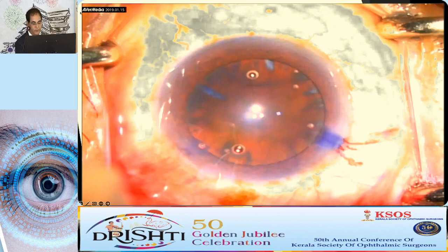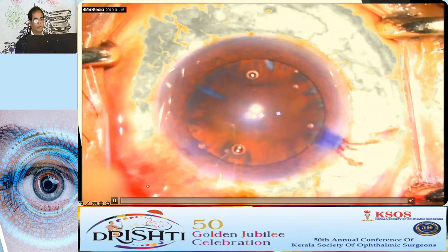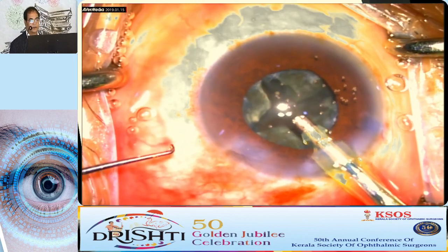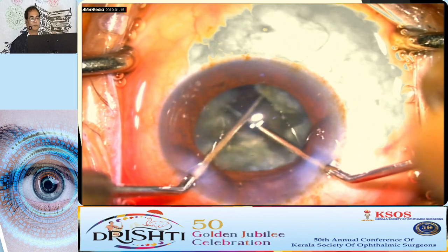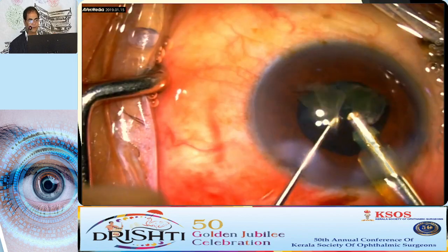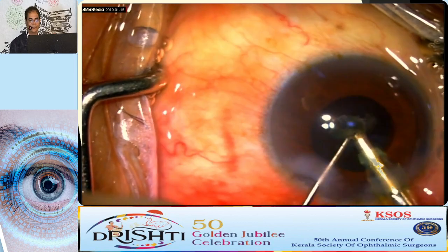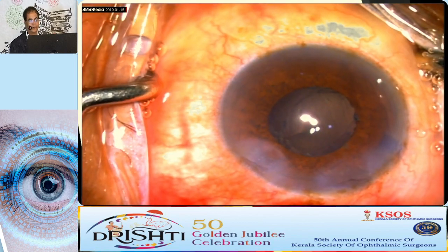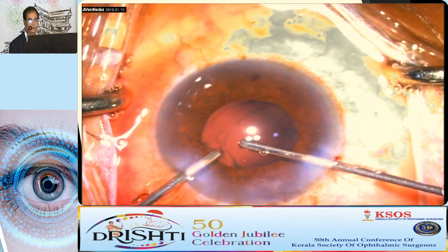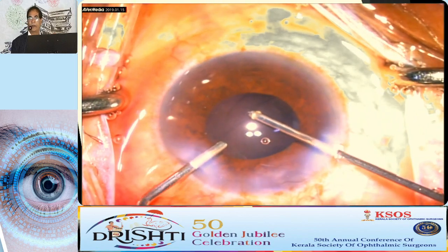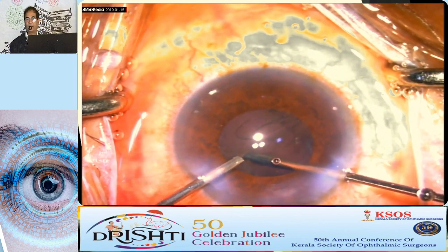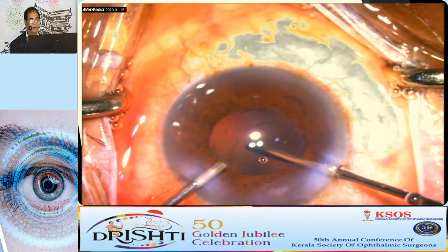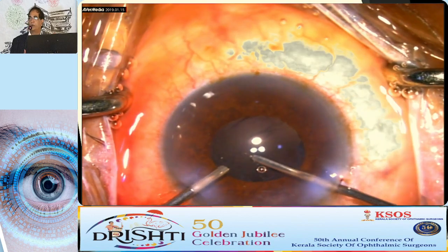This video shows how to go about and manage vitreous prolapse. They are doing the four-quadrant technique and it was going beautifully. This was done by my PG, and once you come to this stage you can see there is a rent. At this stage I have to intervene, and we have to do vitrectomy. You should increase to maximum cut rate — whatever cut rate you have initially — because if your cut rate is low it will drag the vitreous and cause inflammation.